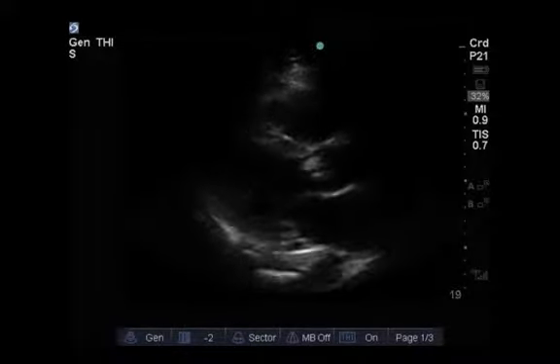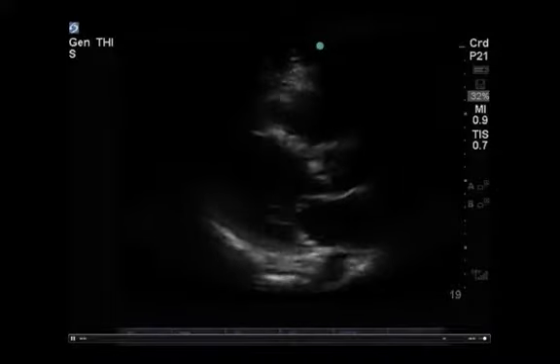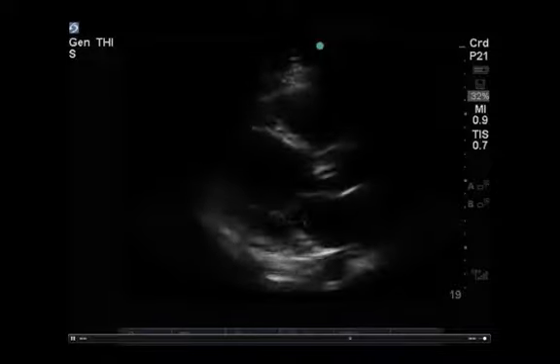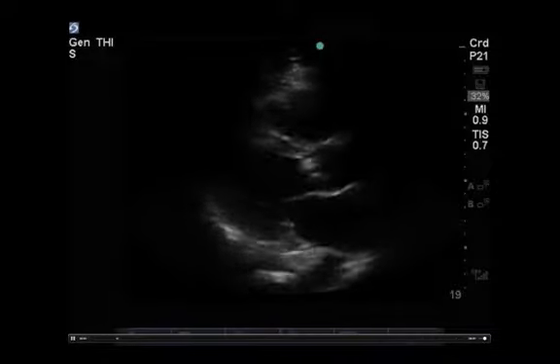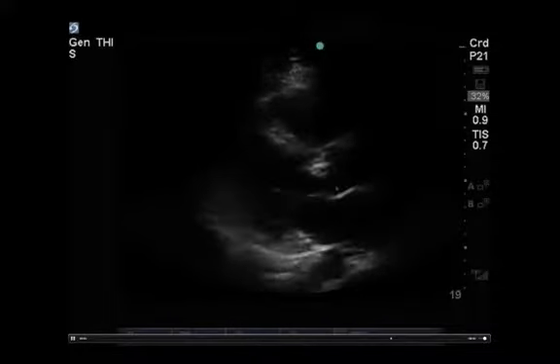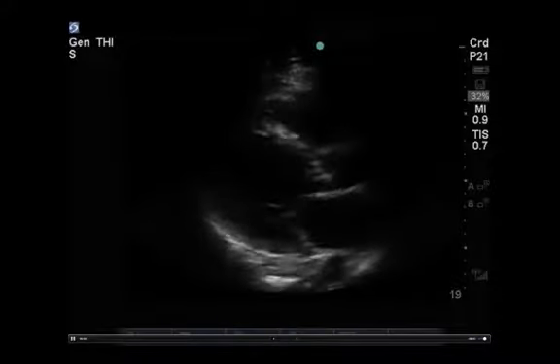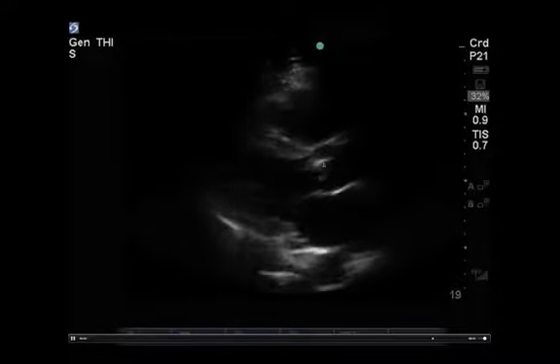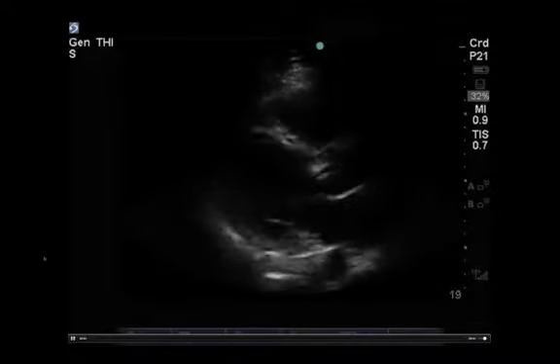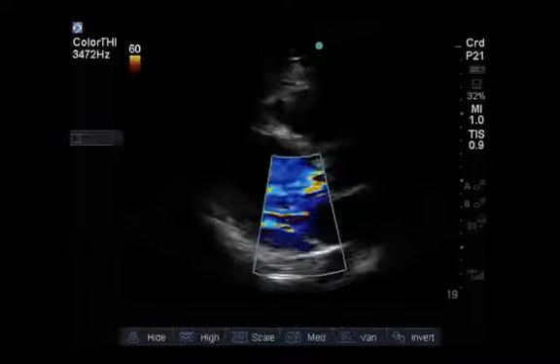The parasternal long axis is available to you here. We turn our attention to the mitral valve. We see some restricted opening of the valve. We see poor or modest resolution of the valve, but no obvious masses or thickening. However, the aortic valve is striking. Normally the aortic valve, especially in a young male, would have very thin and pliable leaflets. The leaflets here are extremely thickened and visible, and immediately your suspicion in this febrile patient, given the clinical context, turns to a possible endocarditic lesion.